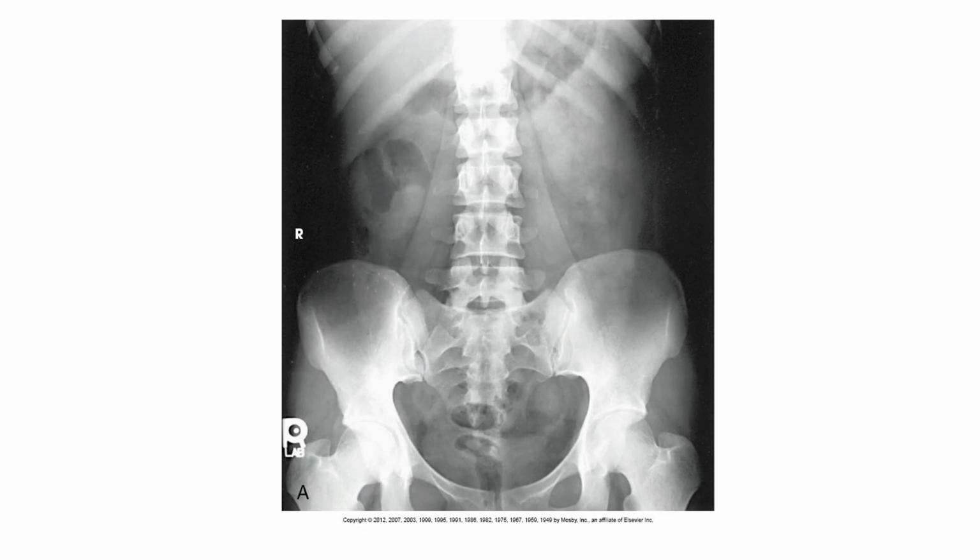Now moving downwards, go back to L1, lumbar vertebra number 1. You see the bright white one, the one just below that, the rough ice cube shape. You see the two tent canvas lines coming off of that? That's the border of the psoas muscle.